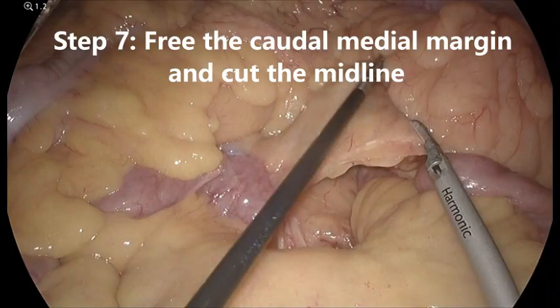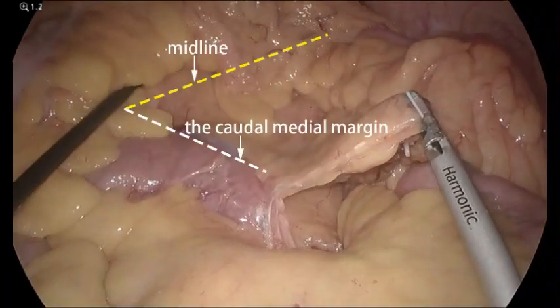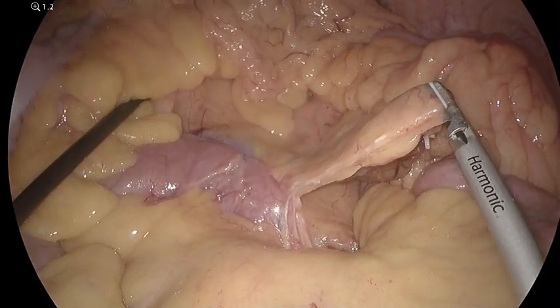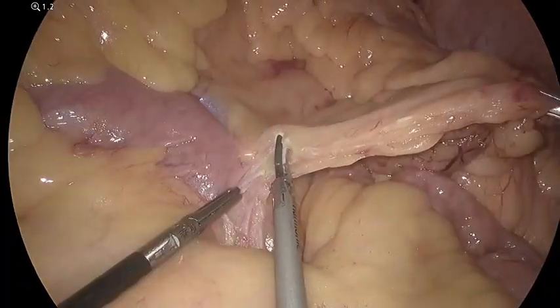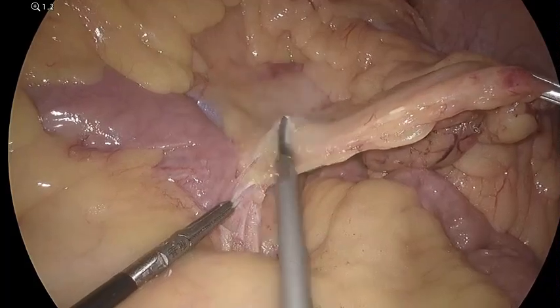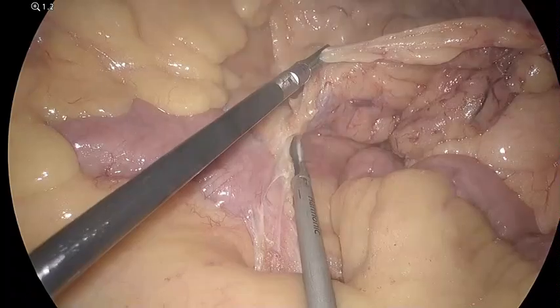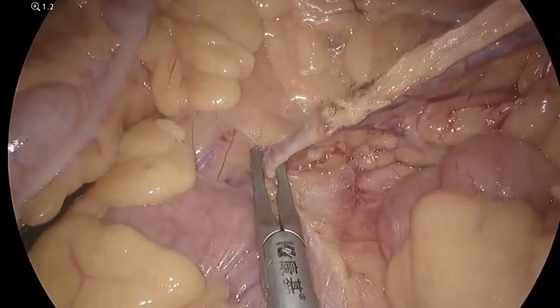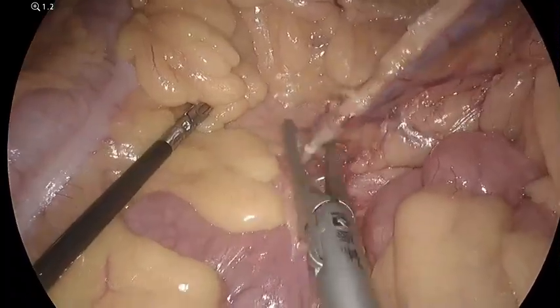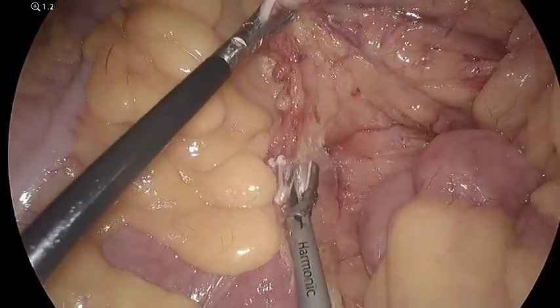Step 7. Free the caudal medial margin. Following the projection of the abdominal aorta and the duodenojejunal flexure, sever the descending mesocolon to the lower margin of the pancreas, including the inferior mesenteric vein. In some patients, accessory middle colic vessels may be present and should also be severed. Sever the transverse mesocolon from the lower margin of the pancreas and incise along the midline.